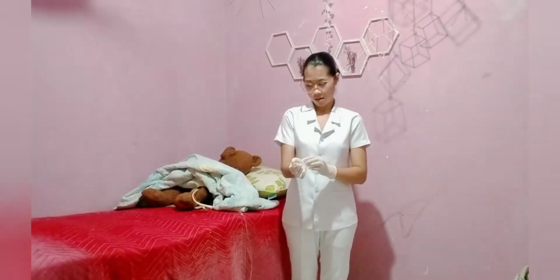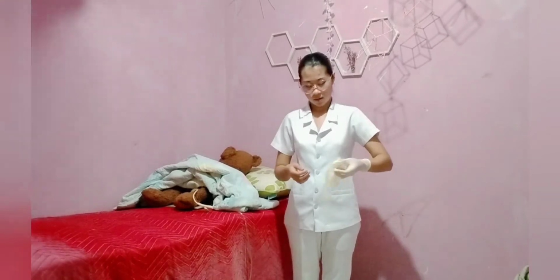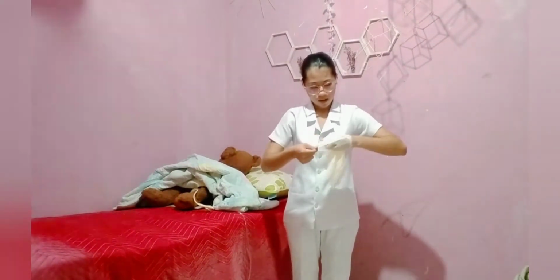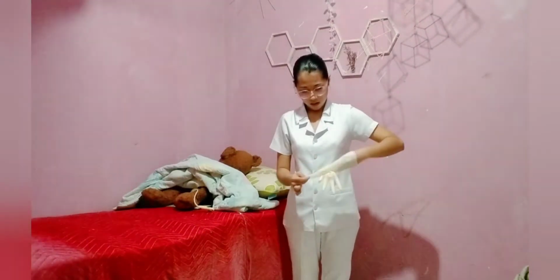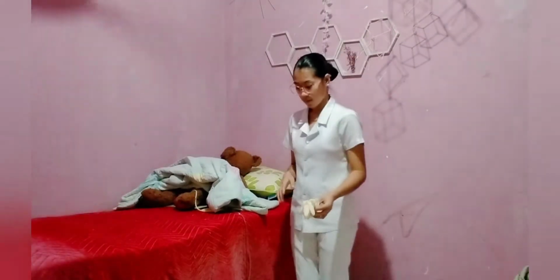And now you can go ahead and remove your gloves. After that, you can place the patient comfortably. This is to provide relaxation to the patient. So, we will discard the gloves.